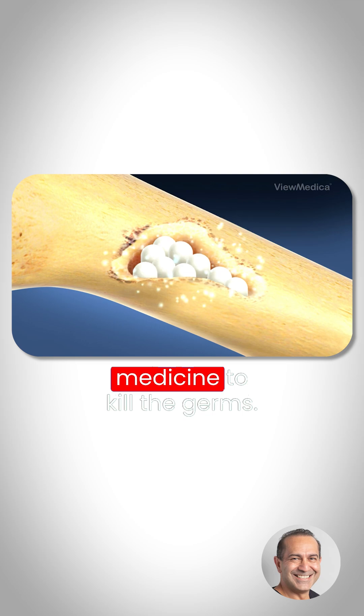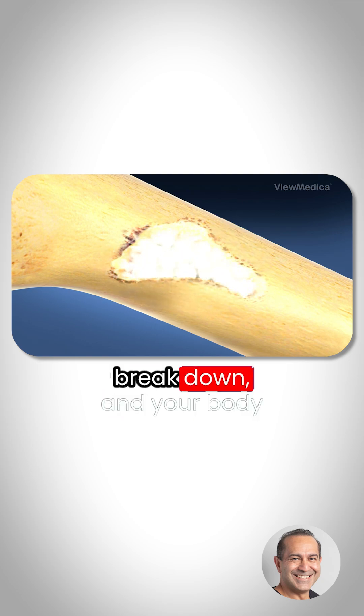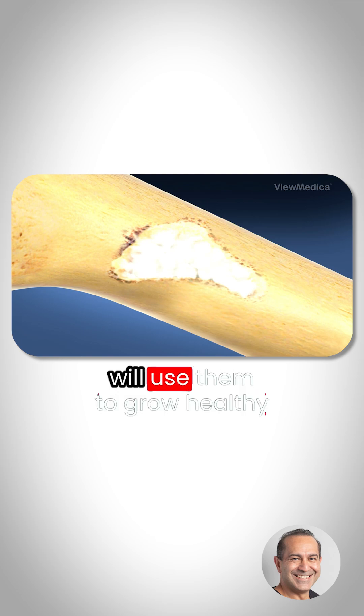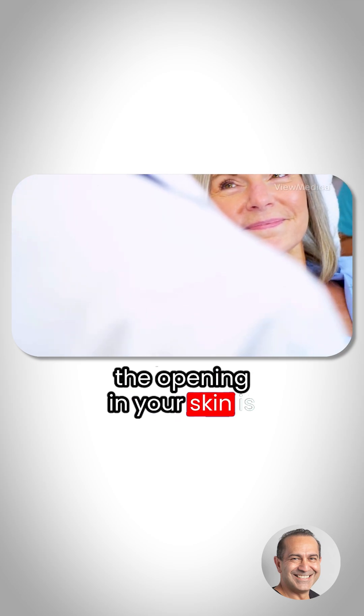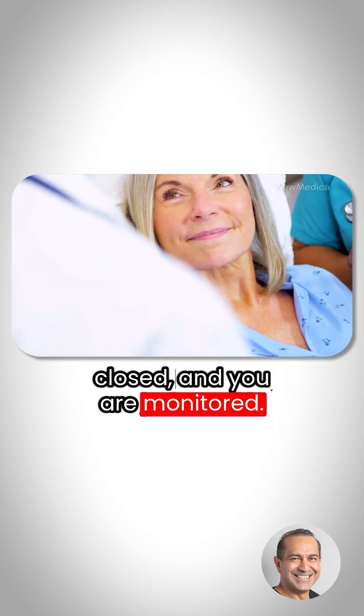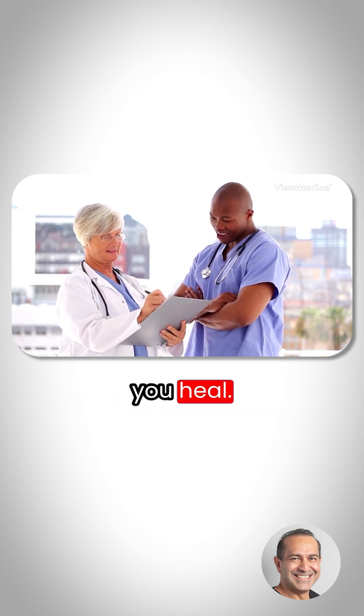The beads will release medicine to kill the germs. Over time, the beads will break down and your body will use them to grow healthy new bone. When the surgery is done, the opening in your skin is closed and you are monitored. Your healthcare provider will create a care plan to help you heal.